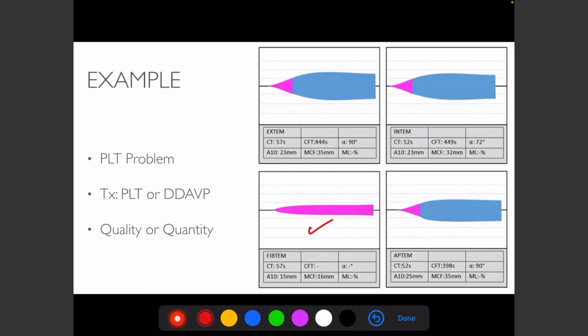So you can think of the utilization for that. Like what Brian was saying, somebody comes in, they have a big head bleed, you don't have their history, but aspirin's kind of there or not in their chart. Maybe they were taking it. If you run something like that and their platelet aggregation is actually impaired, you'll have that result in 10 minutes essentially. So this is something that's a very fast, actionable thing in something like a head bleed.